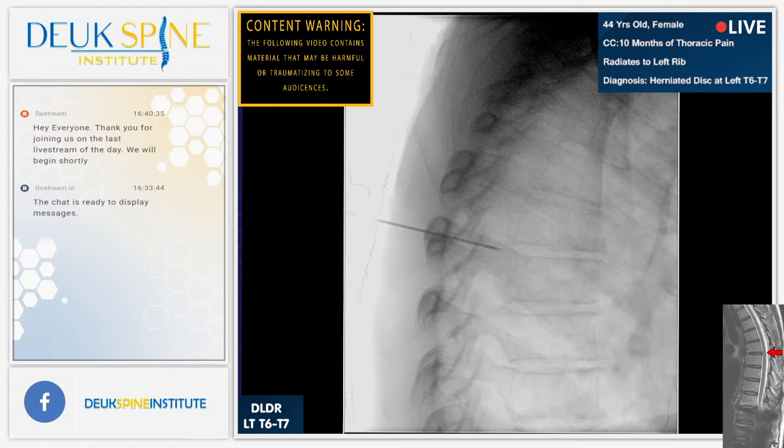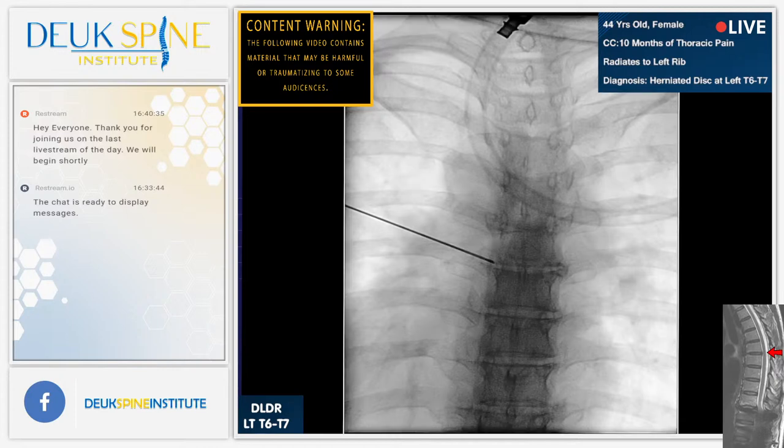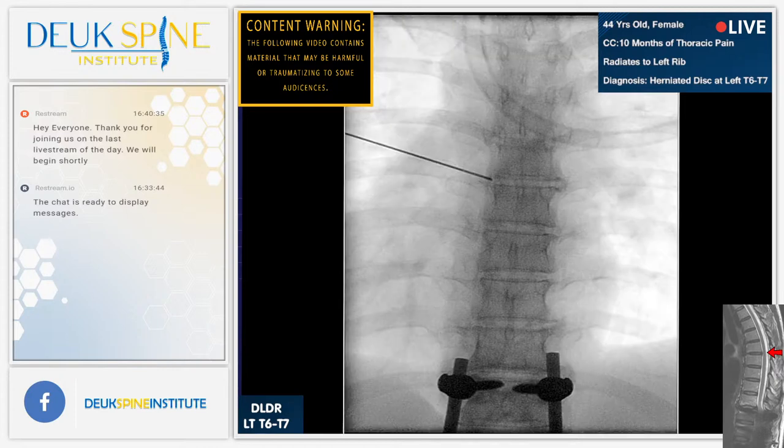All right, so we're using a combination AP and lateral fluoroscopy to navigate down. Oh, that looks perfect. Can you give us a better picture? Because I may use this for one of my talks. I'd just like to make sure. Yeah, that's good. You see that, Henry?